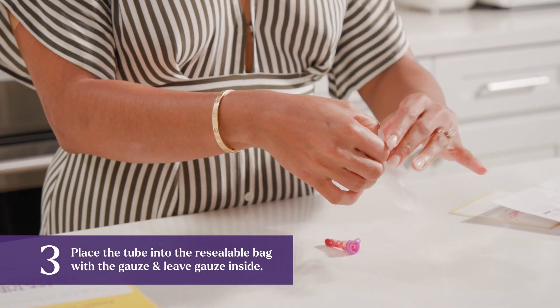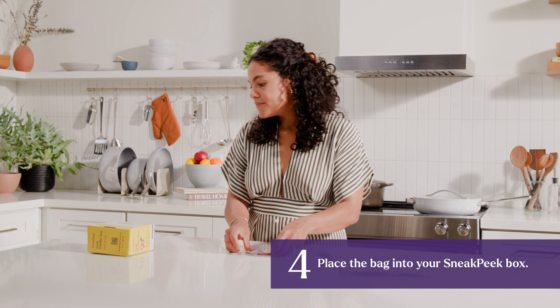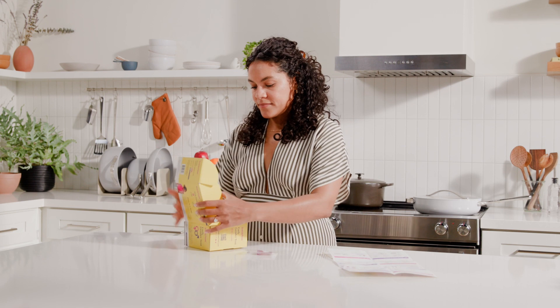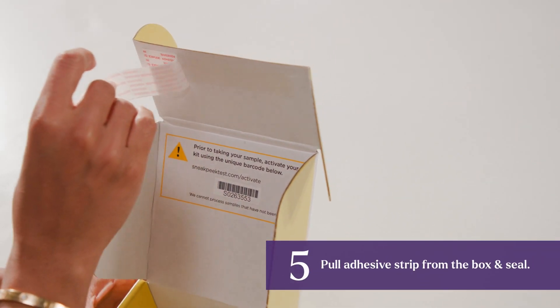Place the tube into the resealable bag with gauze, leaving the gauze in the bag. Place the bag into your Sneak Peek box. Pull the adhesive strip from the box and seal.